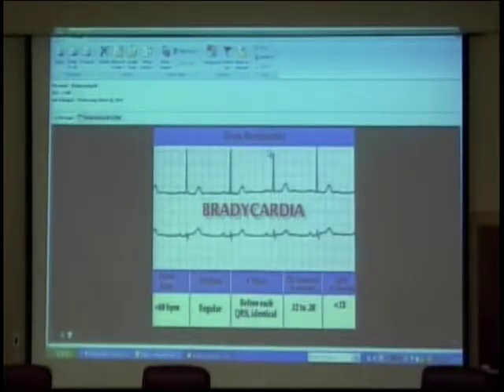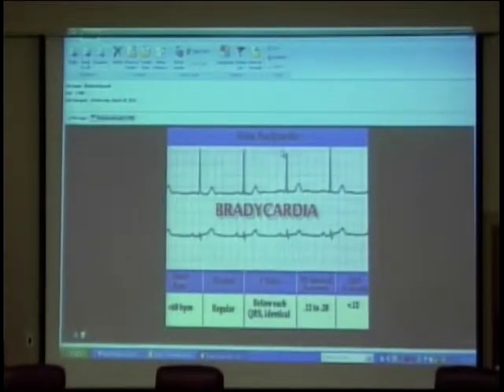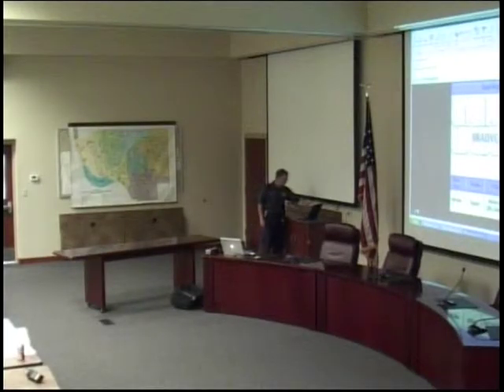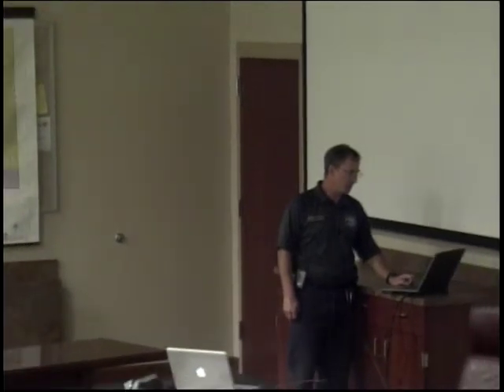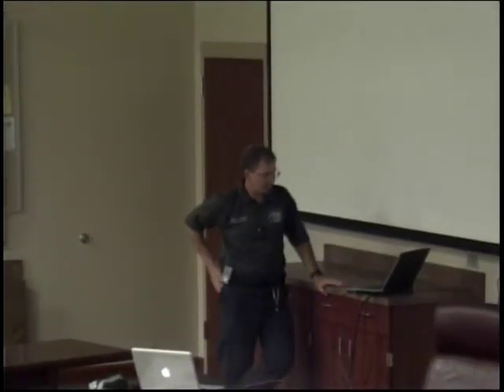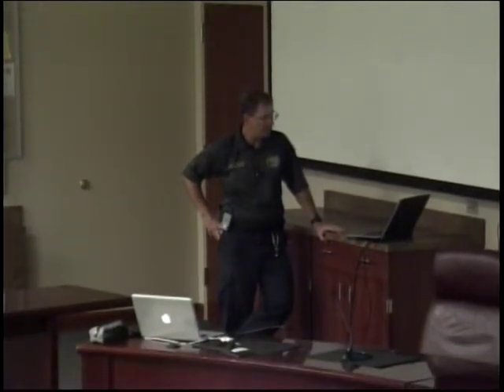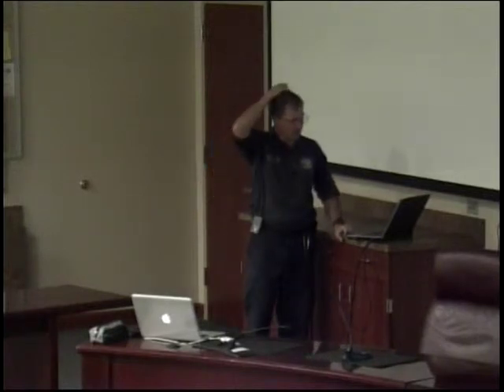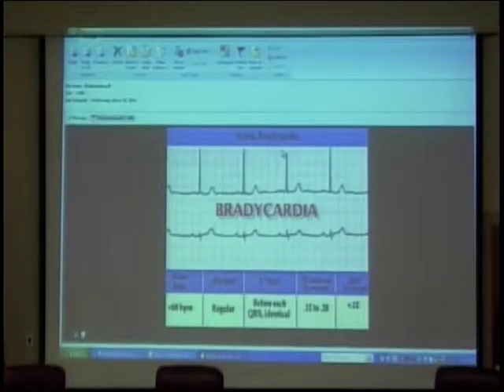All right, guys, my presentation today is on bradycardia, a slow heart rhythm. We'll just start off with a few parameters and get you all up to speed, whoever doesn't know. This rhythm that you see right here is called a sinus bradycardic rhythm. It's less than 60 beats per minute, and by definition, that's what we're going to refer to as a bradycardic rhythm. If anybody has any questions along the way, just speak up.